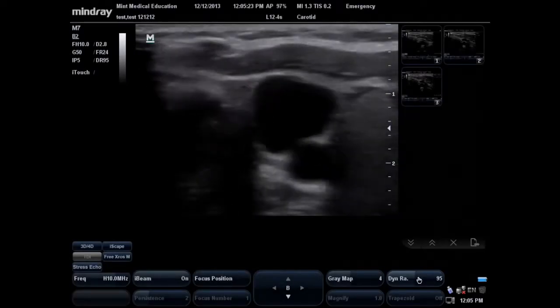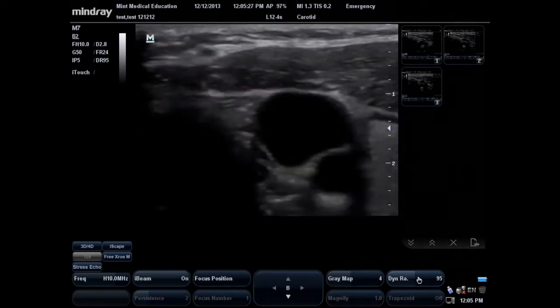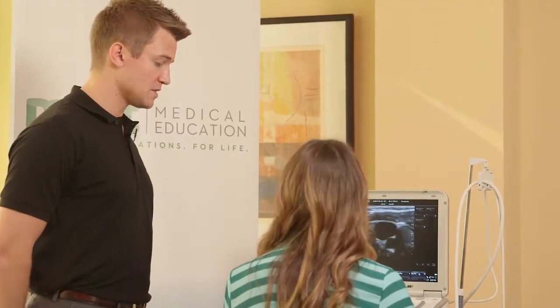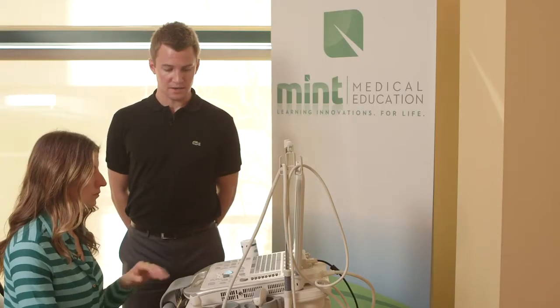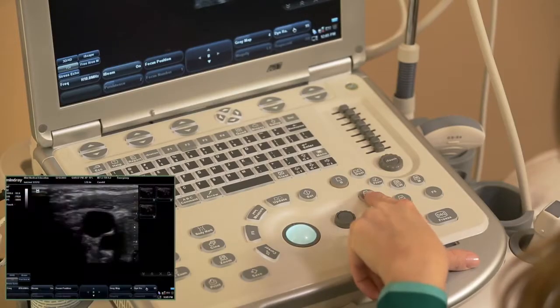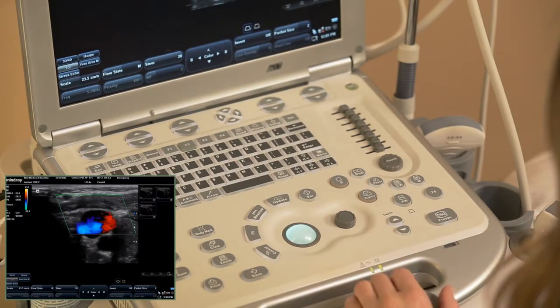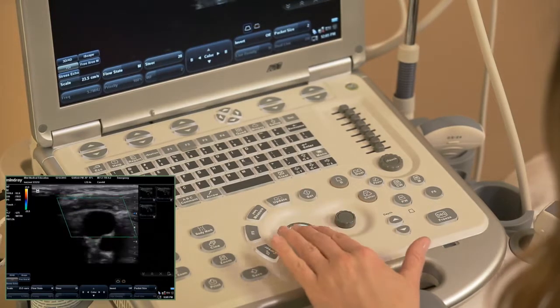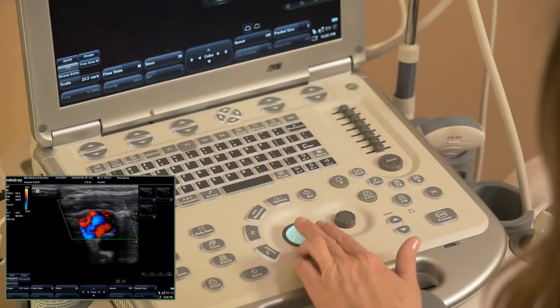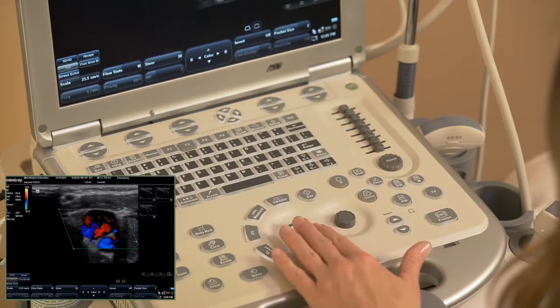So you have a B mode image up there on your screen, and the M7 is a very powerful system, and it has all the modes that come standard on the machine. So the things that we'll talk about next are color Doppler. You'll see that color Doppler button is labeled on the color, and it'll pop up there, and there'll be a certain box size, and it could come up steered just like you have it there. With color Doppler, you are able to move the box. You can change the box size and do that.